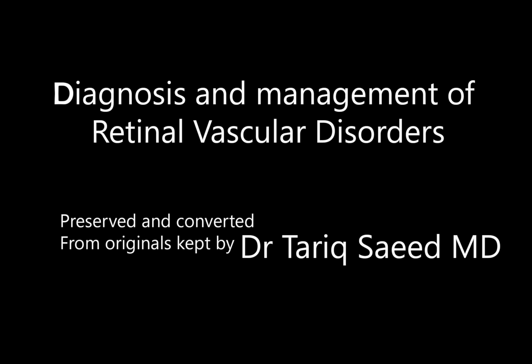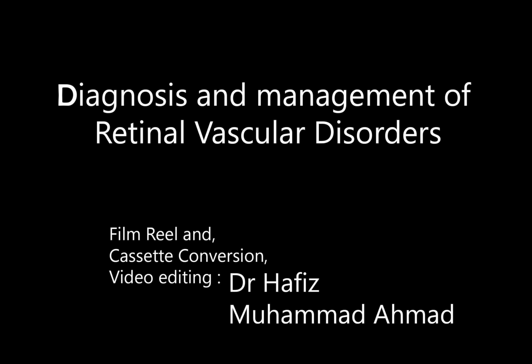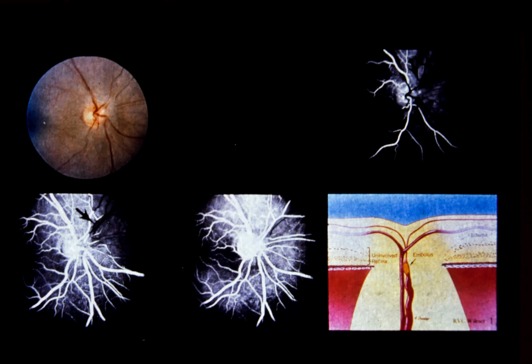Sights and Sounds in Ophthalmology, Volume 2, covers the diagnosis and management of retinal vascular disorders. The fundamentals of fluorescein angiography were reviewed in Volume 1, Diseases of the Macula. Volume 2 is divided into 10 sections, each on a different subject, plus a self-evaluation quiz section at the end. Before starting each section, you may wish to refer to the monograph for some introductory material on that subject.